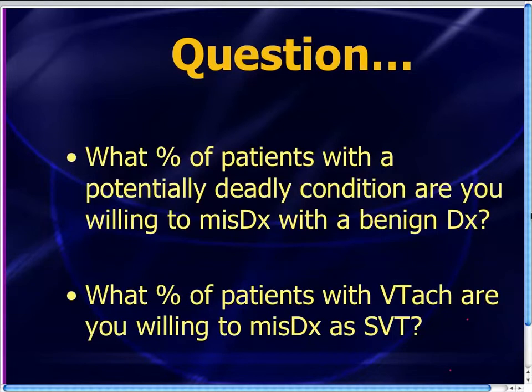All right, so it's a very relevant question. VTAC is a deadly condition. Are you willing to misdiagnose VTAC and call it SVT? And if your answer is yes, what percentage? 5%? 10%? Give it some thought. Hit the pause button and come up with a number.